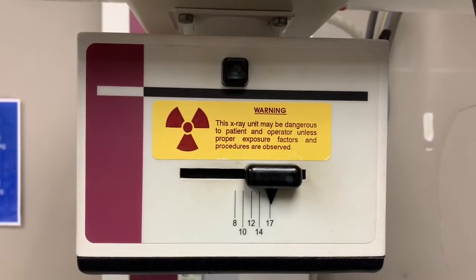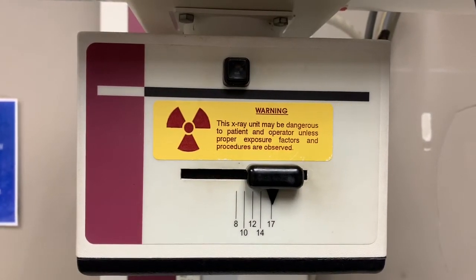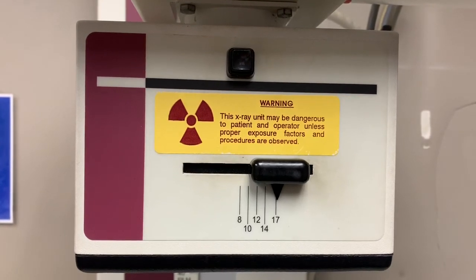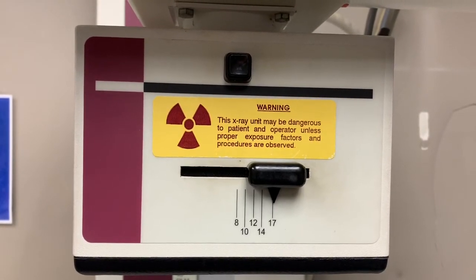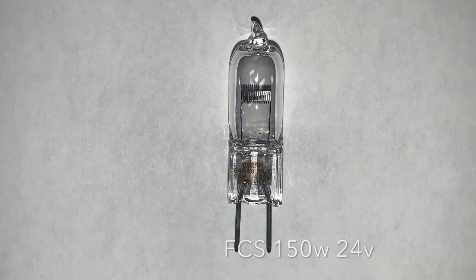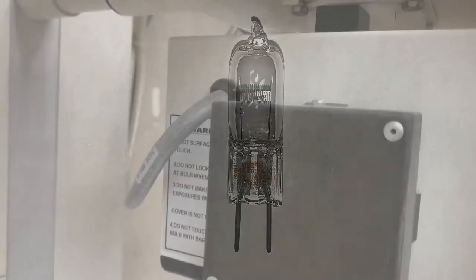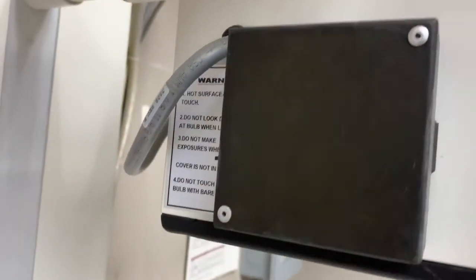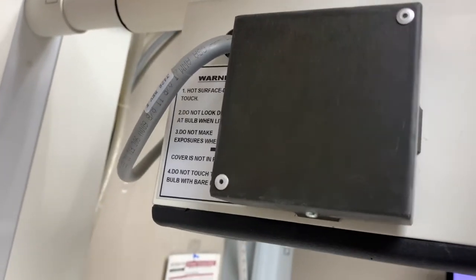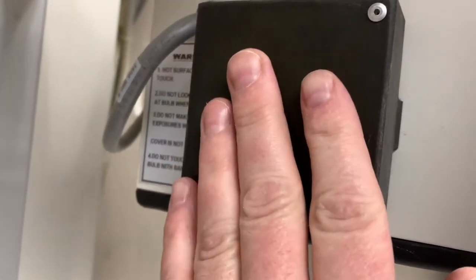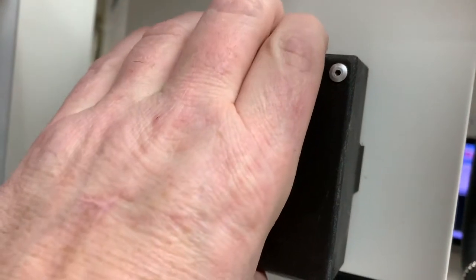This is a V-125 collimator. It uses the FCS 150 watt 24 volt bulb. To access the bulb, press the buttons on the top and bottom to remove the cover, but be very careful—the cover can be extremely hot.